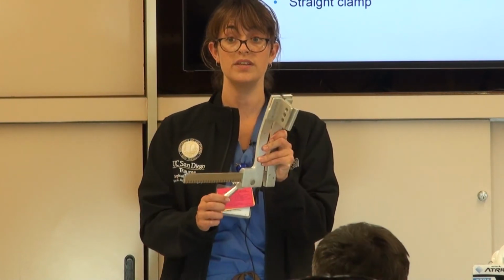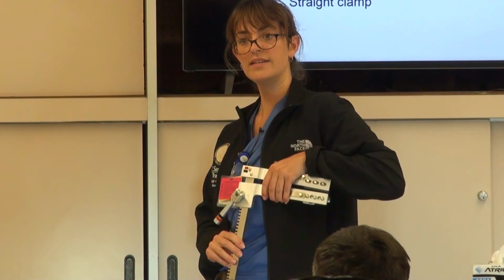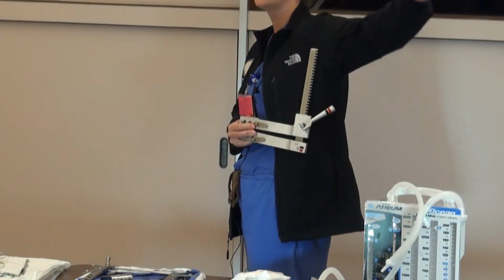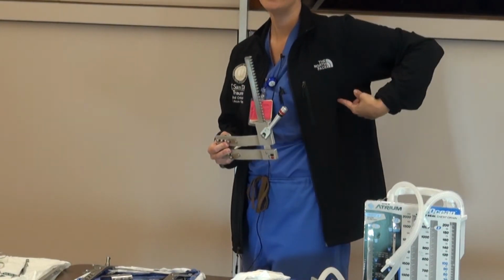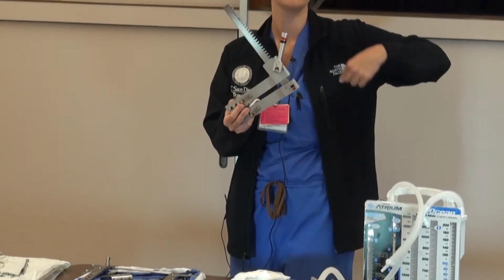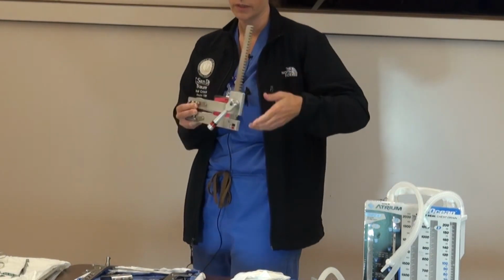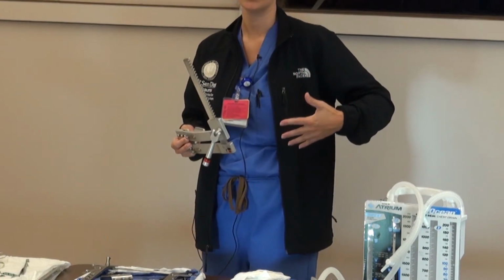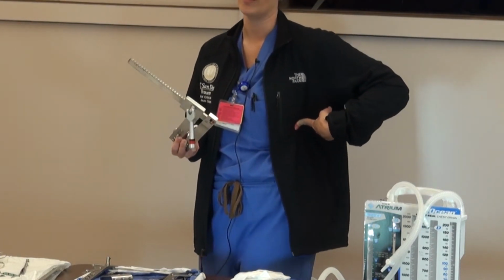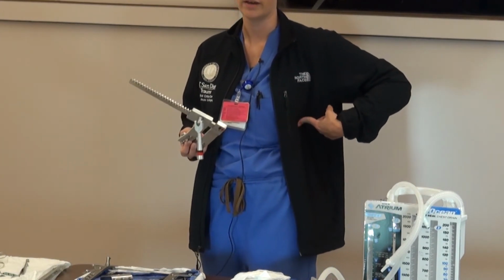Okay, fine. So when we put this on, is it like this? No. It's like this. What's in the way? Shoulder. My arm, the lead, which if I tear it with this, is now metal to metal conducting. People actually get big burns in their axilla. So if you have someone come in who's crashing, don't throw a lead right here. You want to throw a lead right there because it's open and available, and it's on the side and you think, oh, it's out of the way. Not if we're doing a left thoracotomy, it's not, it's right in the way.